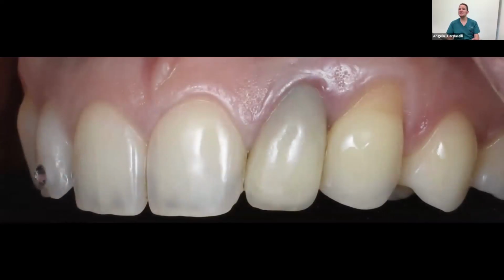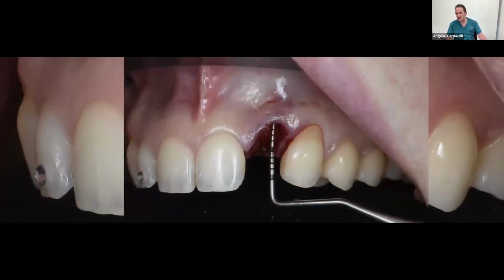Immediate implant placement in the aesthetic zone, have a look at this case. We have a problem, we have a fracture on the lateral incisor in this young patient. So there is no way. If we have a vertical fracture, the only way is the extraction. In that case, we need to remove this lateral incisor, okay? And after the extraction, we have this situation.